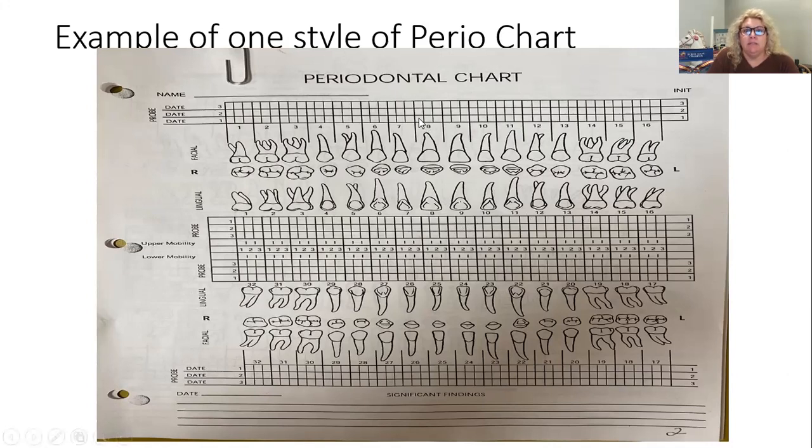Am I in the distal, middle, or mid? And I think some of the videos call it direct or straight for this middle point. We call it mid or middle. And then your mesial of the tooth. So don't forget the surfaces. And this is why it's so important. You got to know those surfaces. Distal, mid or middle, mesial.